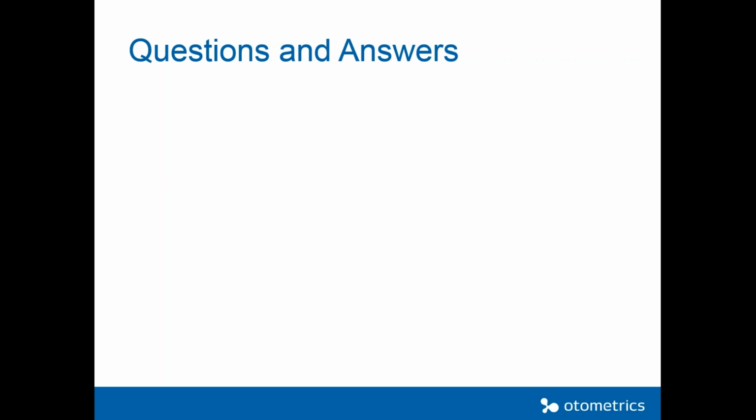Well, technically speaking, yes. On the echo screen we have the option of doing an ABR, and now I'm talking ABR or OAE, because you have the probe, and on the probe you can fit a foam tip that fits an adult ear. I do it all the time actually in my work, and it will give you a result. It will give an OAE, or you can do an ABR.